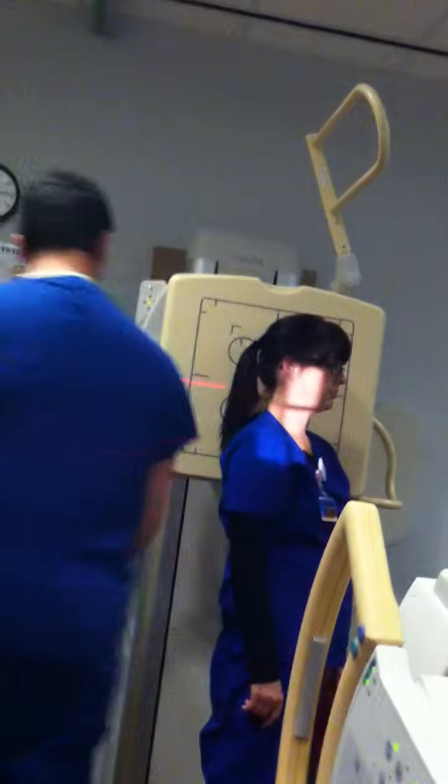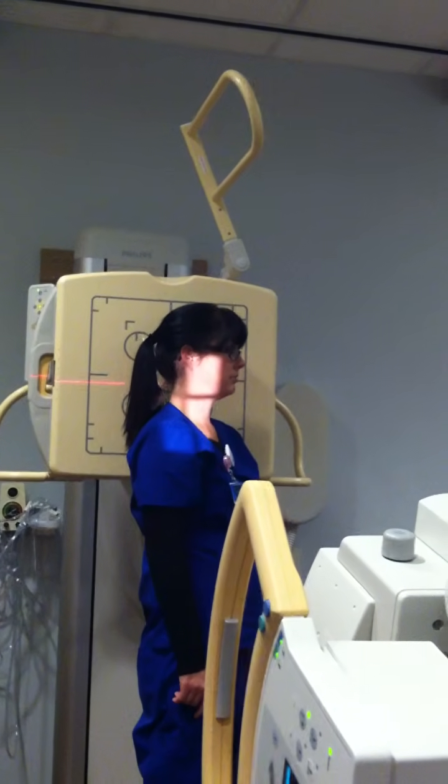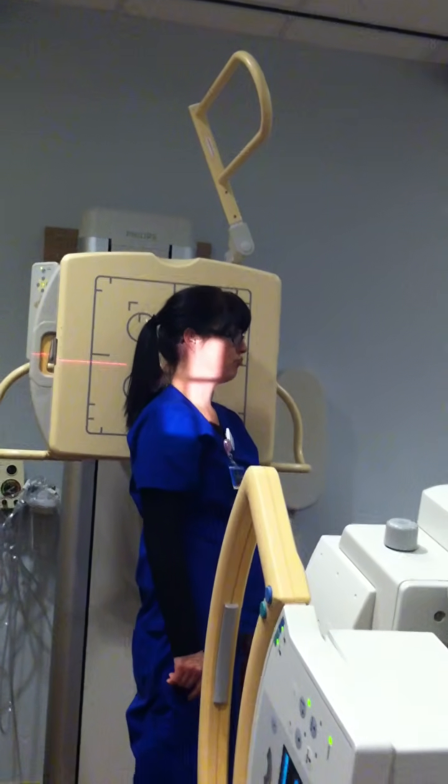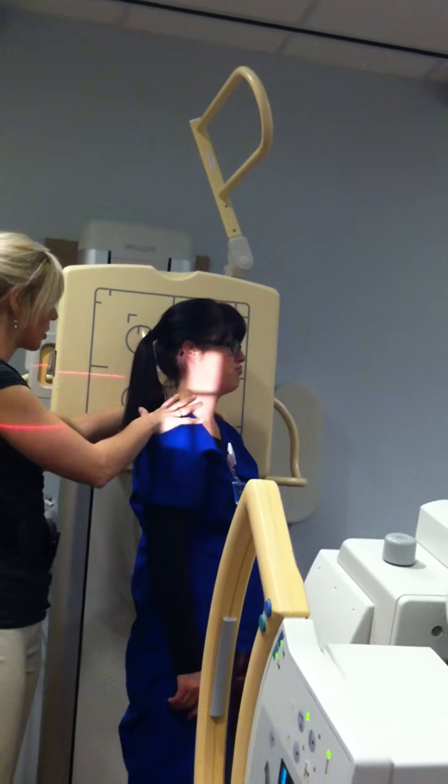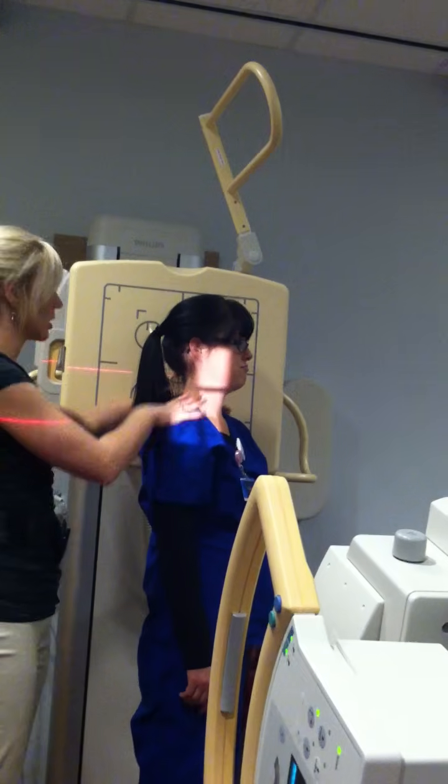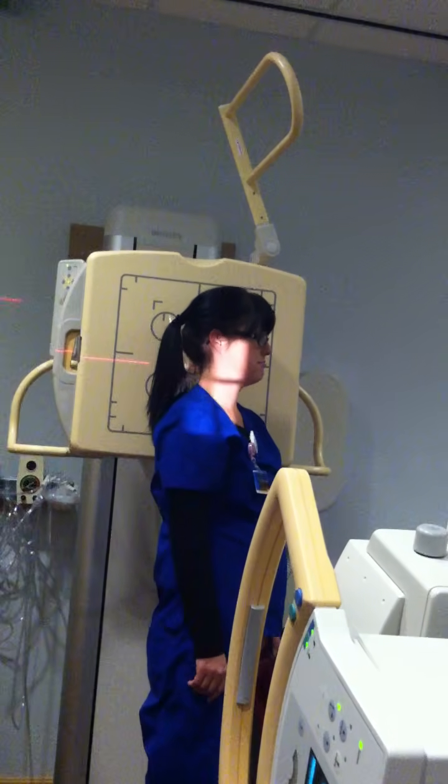Okay. Breathing instructions: expiration. Fold her arms. And again on this one, we can gently remind her when I shoot the picture: I want you to do expiration and push your shoulders down. And then you just kind of guide them. This is what we need you to do.